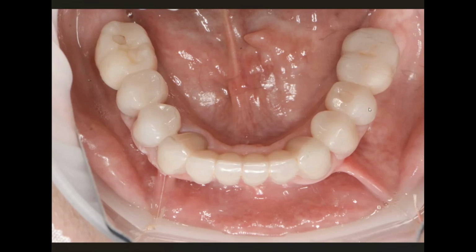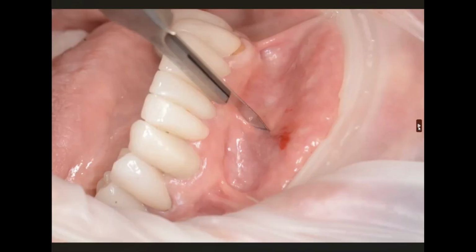And then he had fixed crown and bridge here, 19, 20. There's a bridge from 22 to 27, and I think crowns on 20 to 29. And now he's suffering from recurrent caries. So we're going to do a digital workflow here.